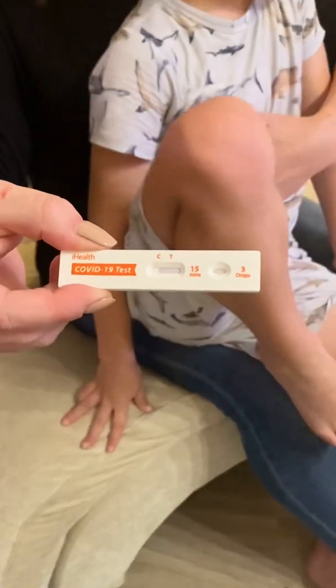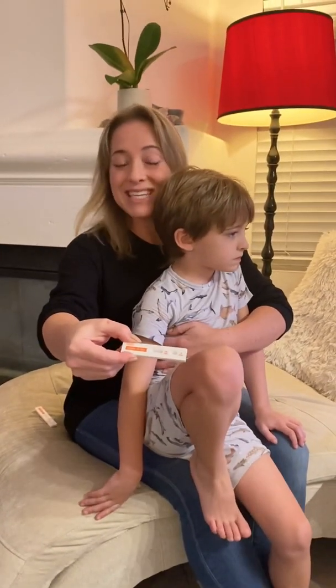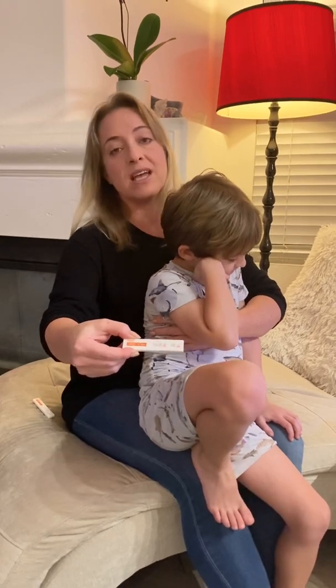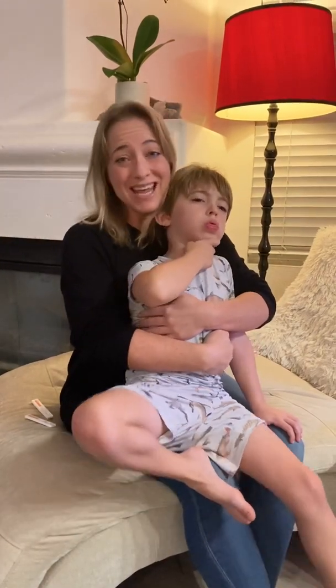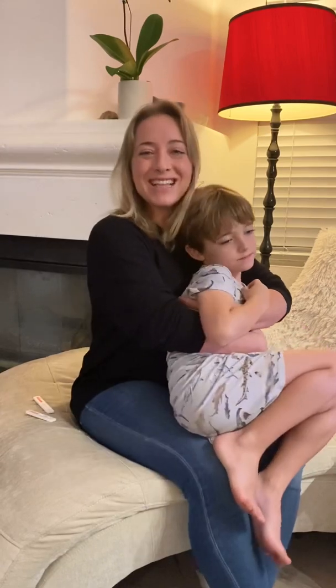We're going to check back in 15 minutes to see if we have one line or two. If we have one line, he just has a different cold but does not have COVID. If there are two lines, then it's COVID. Keep in mind that even if he doesn't have COVID, if he's sick, he should stay home from school and keep his friends and classmates safe. Take care.